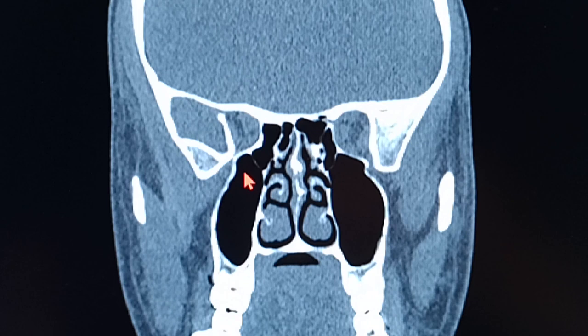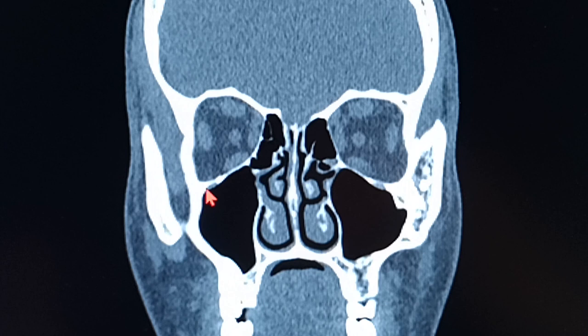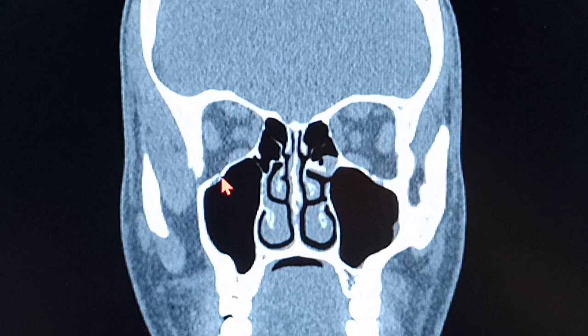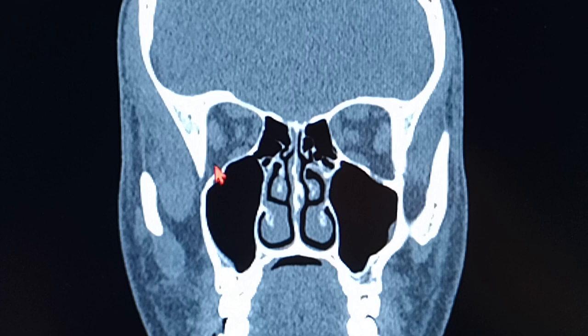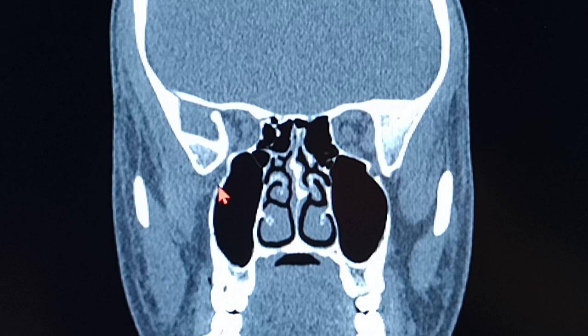You can see the temporal lobe coming here in the picture. Now concentrate on the inferior orbital fissure. The moment you see, this is an intact bone over here. That's the intact bone. The moment you keep on going behind, you can see an opening over here. This opening is the inferior orbital fissure, which is going on to the temporal area anteriorly. Then we are going to go still behind. And now this is the inferior orbital fissure, which will be in connection to the pterygopalatine fossa.